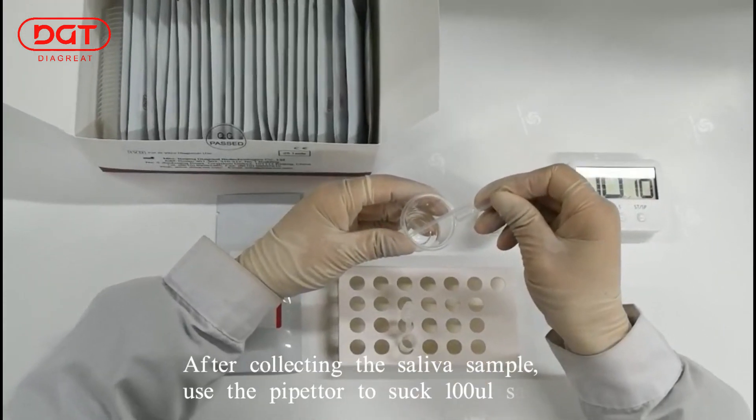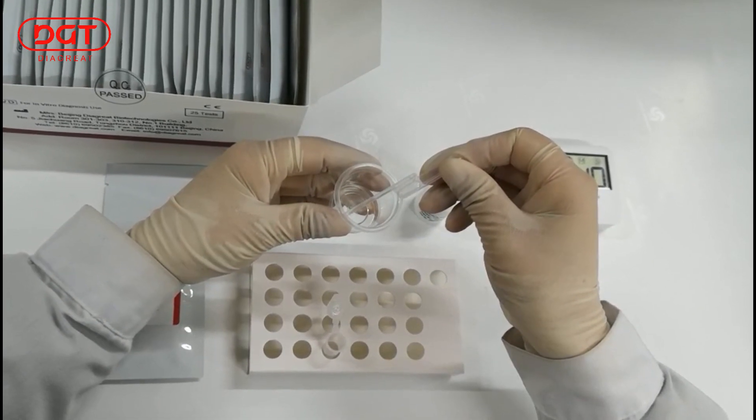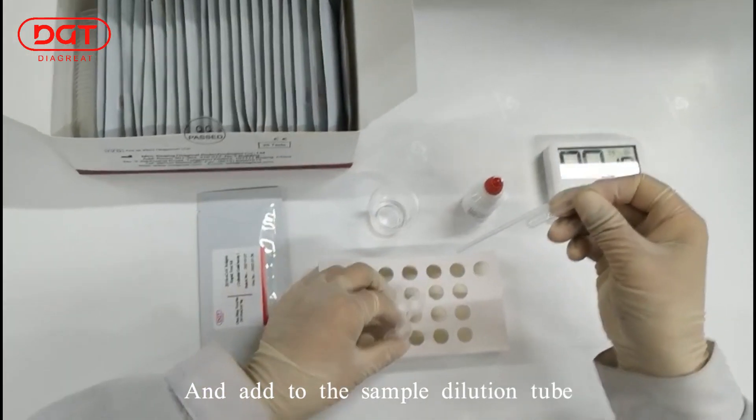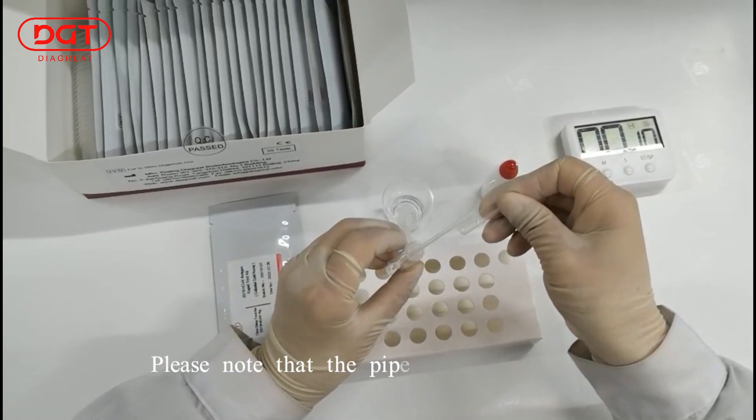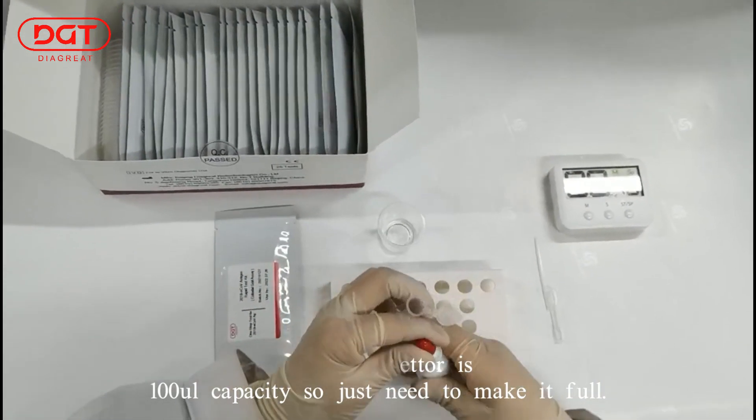After collecting the saliva sample, use the pipette to suck 100 µL sample and add to the sample dilution tube. Please note that the pipette is 100 µL capacity, so just fill it completely.